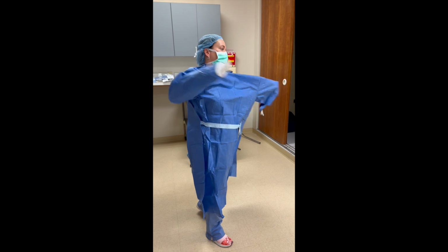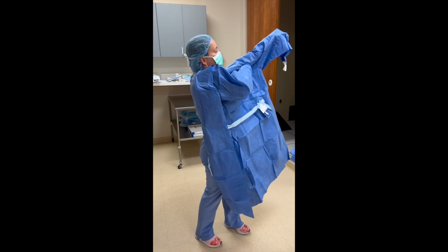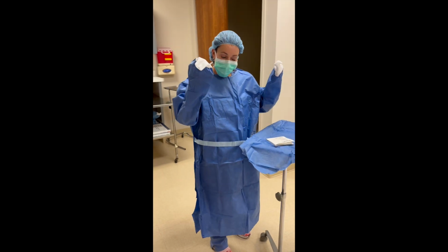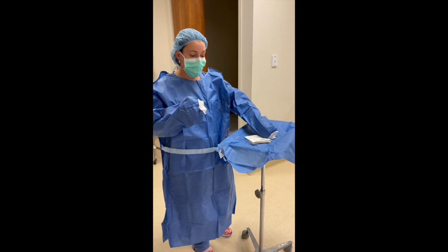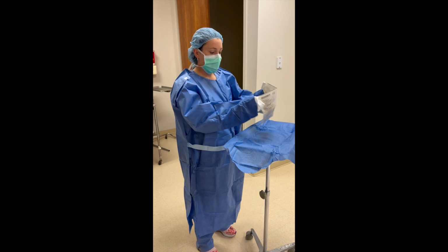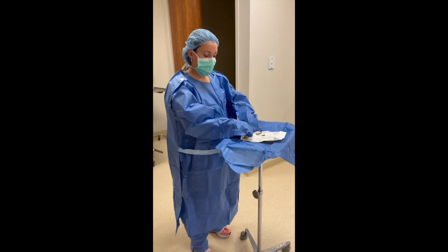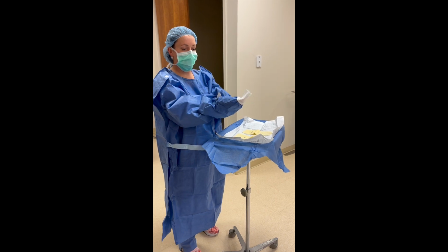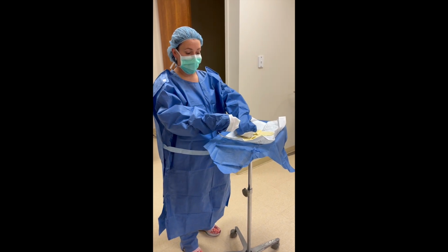I'm going to put my arms through here and here. And so I'm still sterile. This is still sterile. Usually somebody comes and helps and ties me up at this point, but you can still do this part. So I open my sterile gloves, just like so. A lot of people like to do that flip glove technique. I don't do it, doesn't work for me.